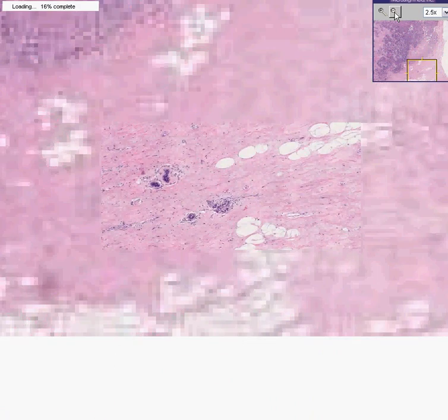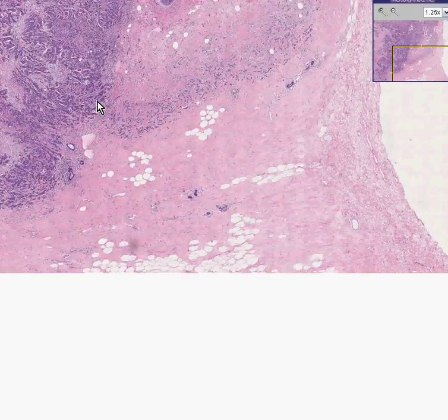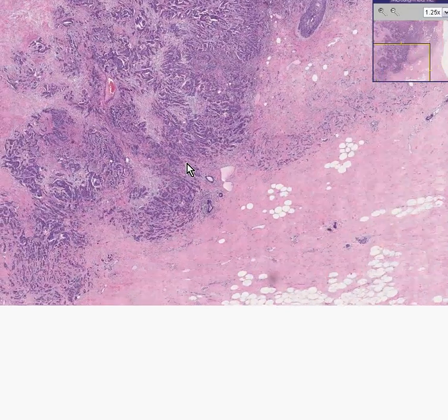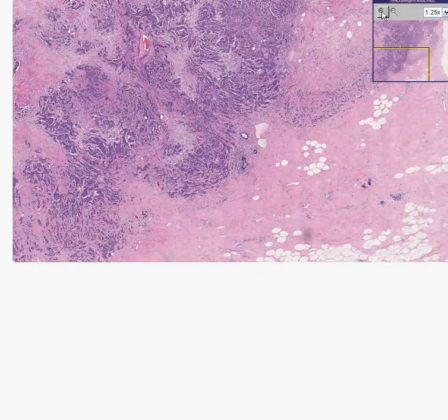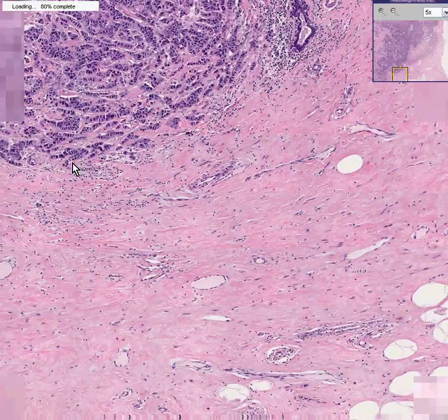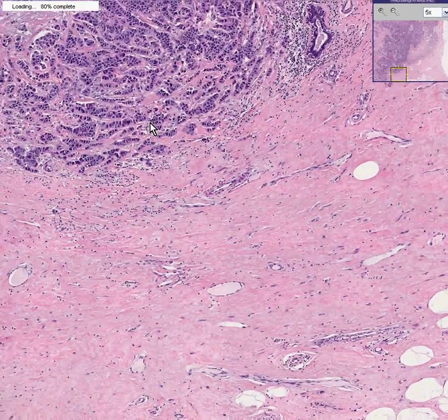Notice that there is something also terribly wrong with this breast. Notice you do not have normal lobular patterns here. Sure, you have epithelium like you would see perhaps as part of a gland, but you can also see that this is not in a nice little cluster, and it kind of infiltrates irregularly. These are all infiltrating little nests of breast cancer.